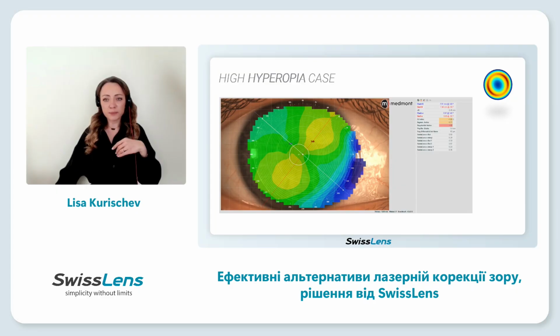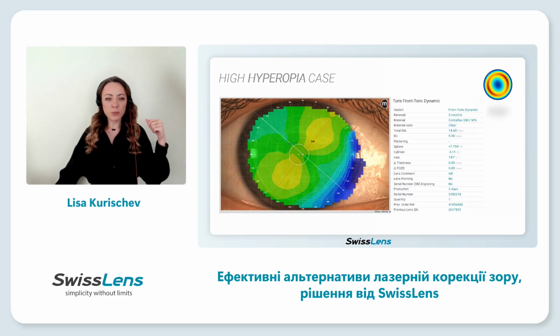Reviewing the full medical history of the patient, it turned out he has atopic eczema. As we know, this could be linked to dry eye, but nevertheless, we start with a soft lens. For the right, we use these parameters. I took directly GM3 58.